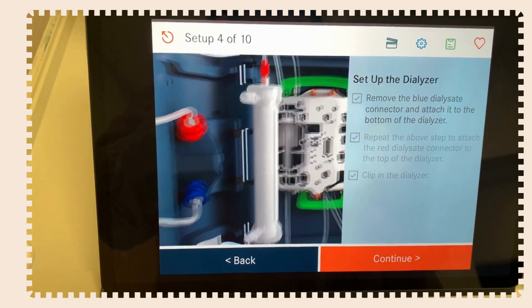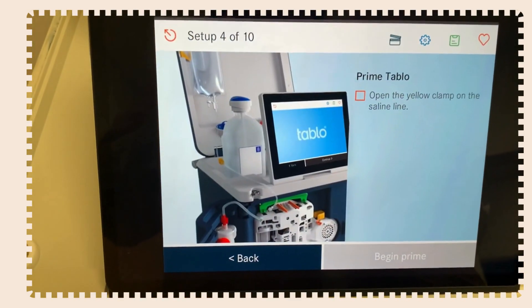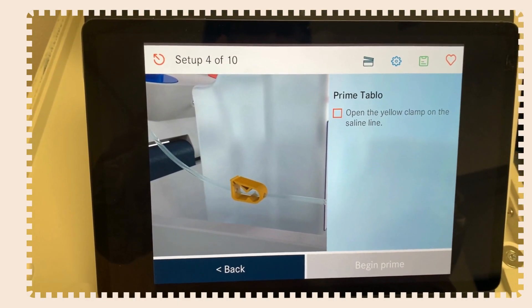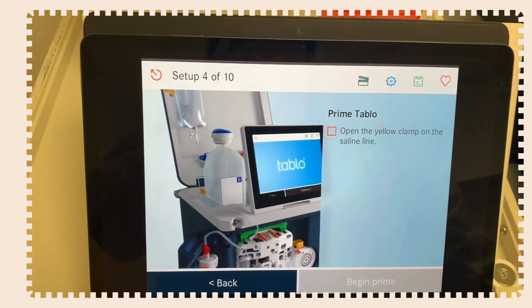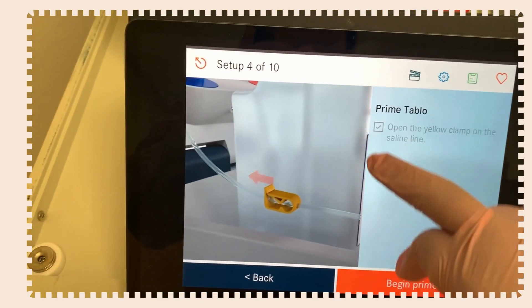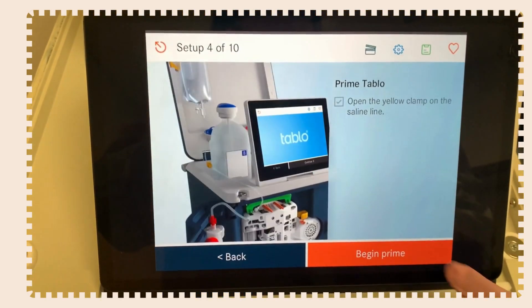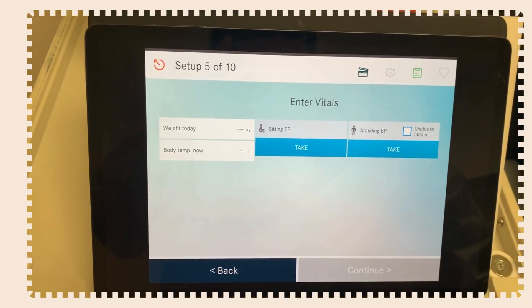Now let's prime the Tablo. In order to prime it, you have to open the yellow clamp on the saline line, then hit begin prime. While that's priming, you'll complete your pre-treatment checks.